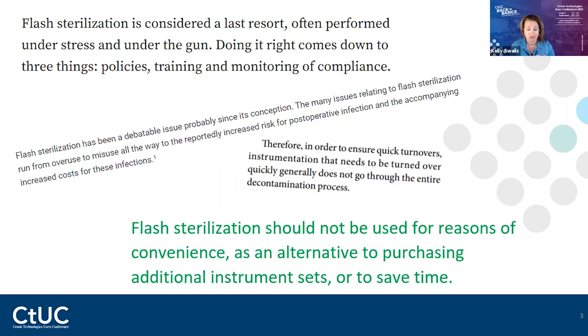Especially in hospitals or facilities where you have an OR that does it. If the OR is doing their own IUSS sterilization, is there a mechanical washer up there? I'm guessing no. Or if they're sending it down to be washed, great, but then that's even more time for transferring all that. So there's a lot of concern about that cleaning.